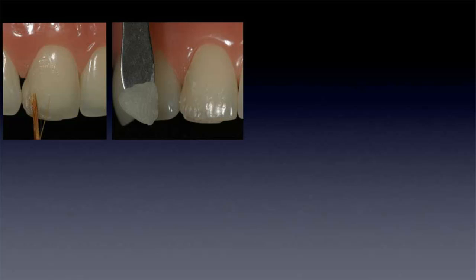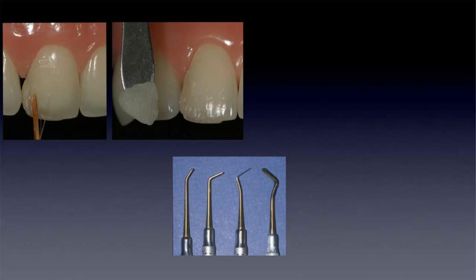Now, a critical thing is don't overbulk. Remember, you just want to build to what you want, to the contour that is there. You don't want to overbuild the contour because then it's just going to take more time during the finishing and polishing phase. So take the time to just use enough to do what you need to do, and then from there, I'll tell you, you're going to make your clinical life so much easier.